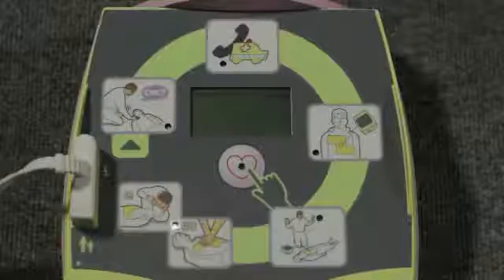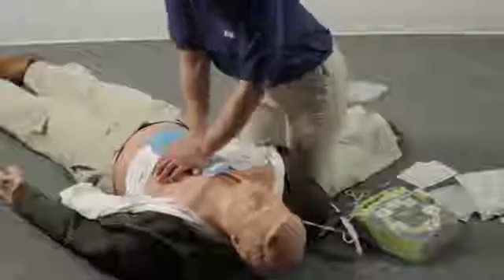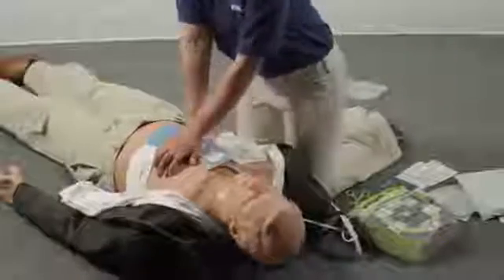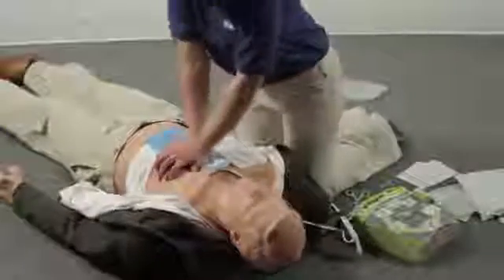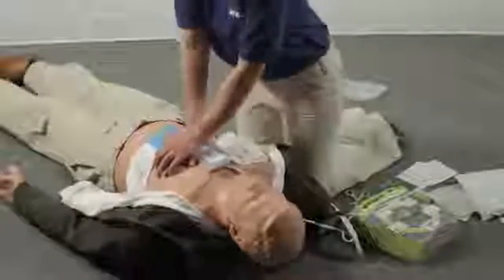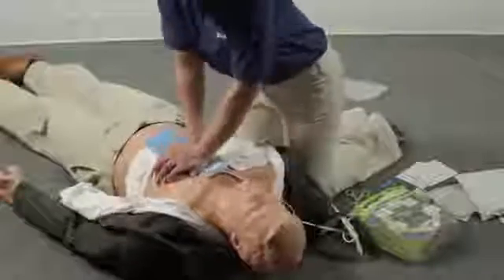After giving 30 compressions, you should give 2 rescue breaths. Repeat this cycle of 30 compressions, followed by 2 rescue breaths, until the AED Plus tells you to stop CPR. Rescuers who lack the training or confidence to perform rescue breathing should perform continuous compressions without stopping.